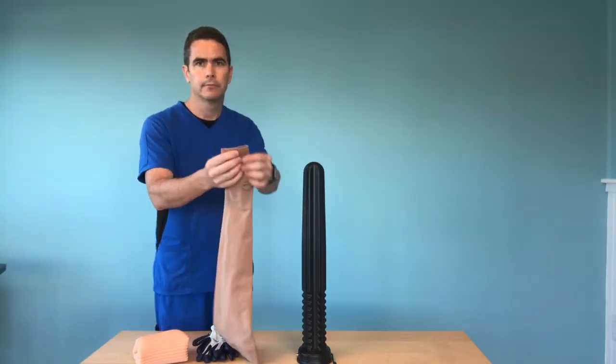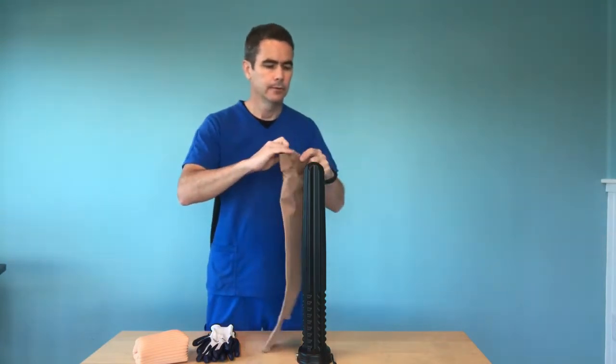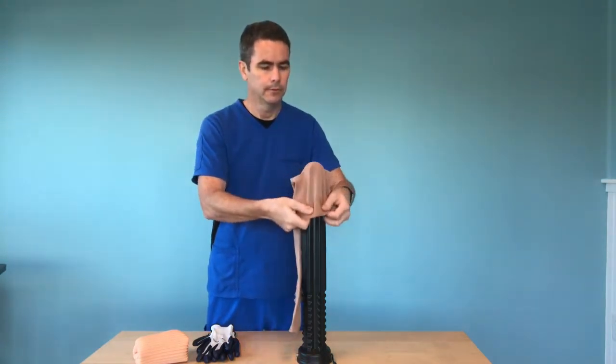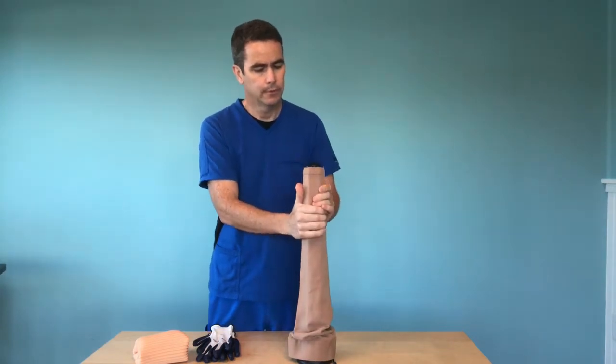In this video I am using a thigh high compression sock. This technique can be used with a knee high as well. The point of this video is to show how to use the Dauphin Donner with the open toe.